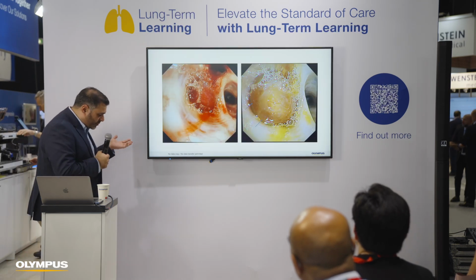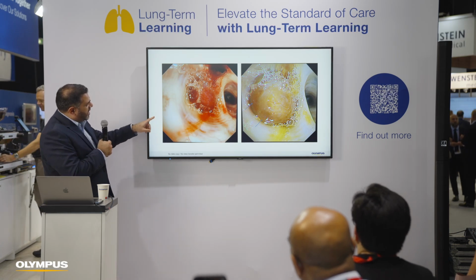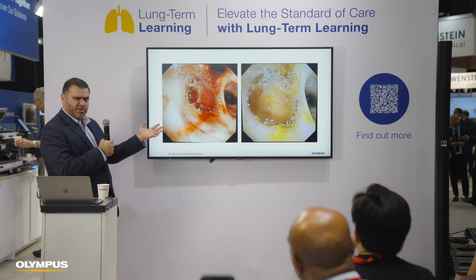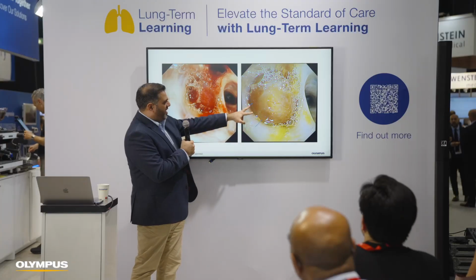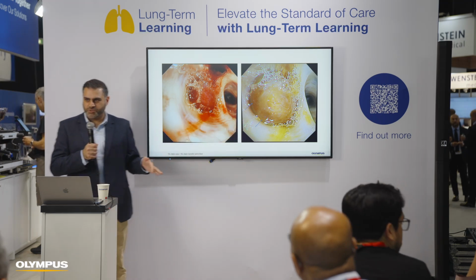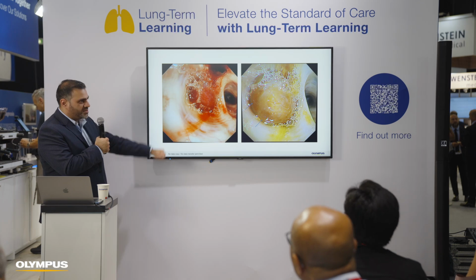This is what the endobronchial appearances look like. So blocked right middle lobe bronchus. And does anyone guess what this is? Cherry red, looks like a carcinoid tumor, and you switch to the RDI, and you have these really, really deep vessels here, and actually you just look at this the wrong way, and it just started bleeding.